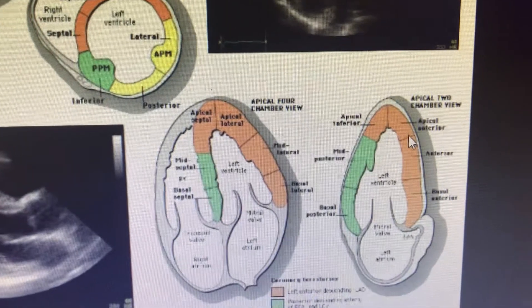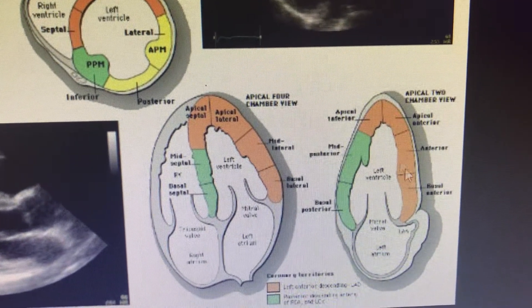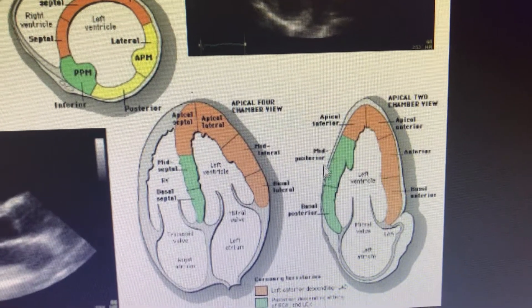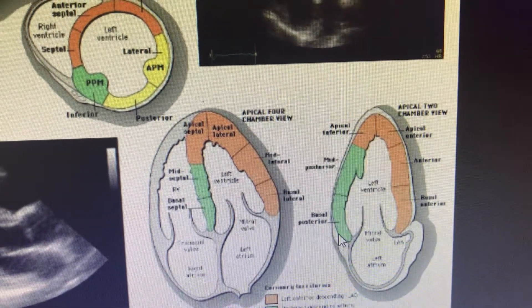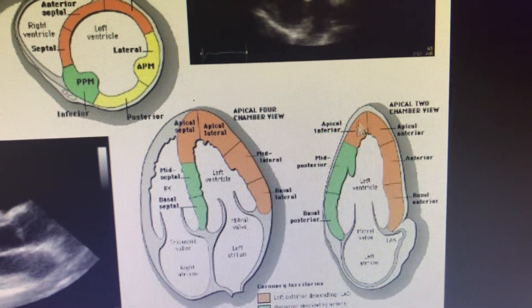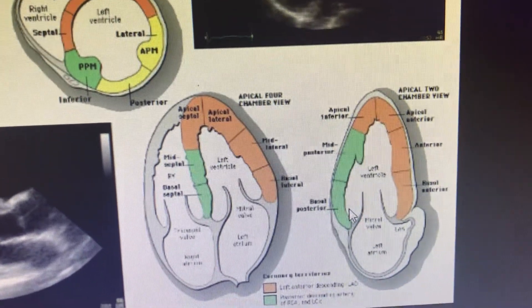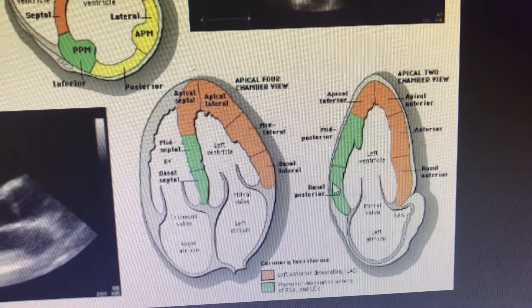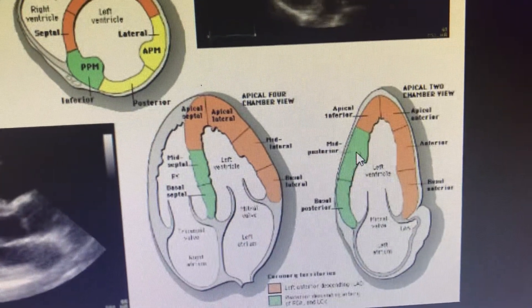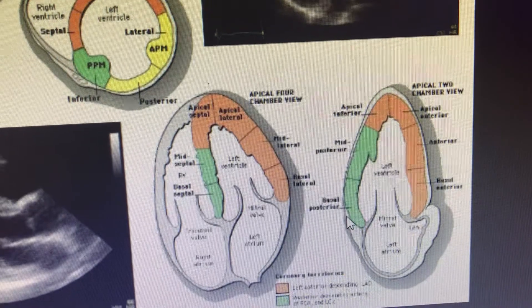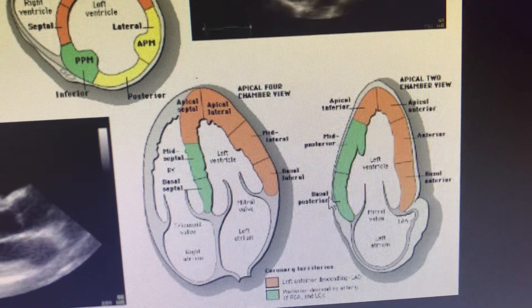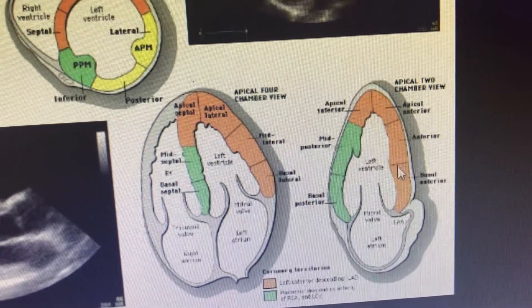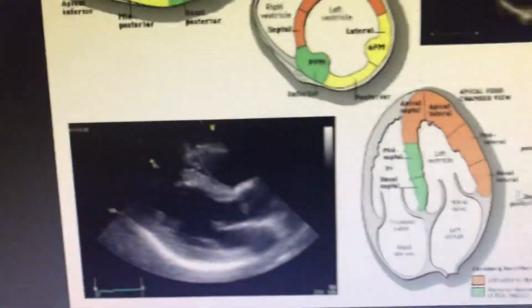It's very important to differentiate. The 4-2 chamber view focuses on the anterior and the inferior walls. The basal inferior, basal posterior, mid posterior, and the apical segments — the mid posterior or basal posterior will be inferior — are supplied by the PDA. The apical and the anterior-most part are always supplied by the LAD territory.